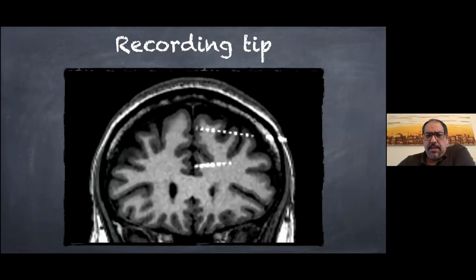The recording tip is important because, for example, when we want to record from the cingulate gyrus cortex, we need a recording tip. Otherwise, we will be obliged to go over the cortex.